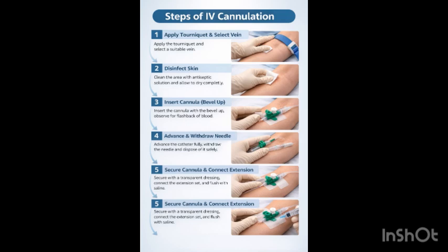And you need to pick the cannula with thumb and middle finger. That will be the easiest way you can pick the cannula, so you can stabilize it using your index finger. You can identify the point of needle insertion. You can pick the straight veins, which will be easiest to put. Then approach at a low angle to enter the skin, then vein. You can use the angle of 5 to 10 degrees.